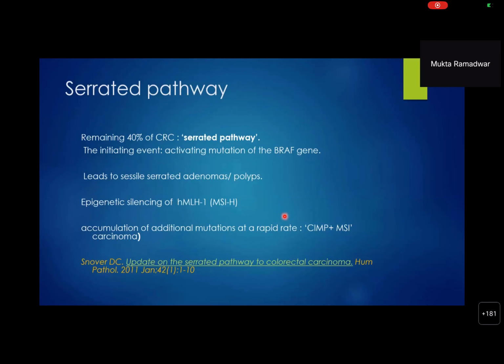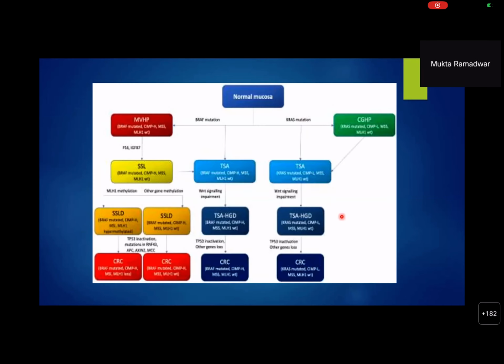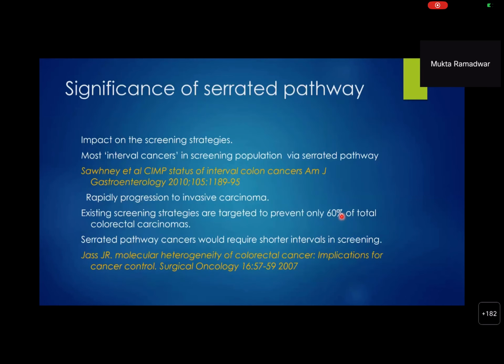So let's move ahead. Prachi Madam, at this moment, just one quick comment. So sessile serrated polyps, as you said, are very pale as compared to the conventional adenomas on endoscopy. The conventional adenomas, the more dysplastic they get, the higher the grade of dysplasia, they become browner on imaging. So they are very easy to spot to trained eyes, and they are darker. But the hyperplastic family of polyps are paler, with a typical cloudy appearance, and they are flatter than the conventional adenomas. So that's why they are easily missed on endoscopy unless you are really looking for it very diligently.